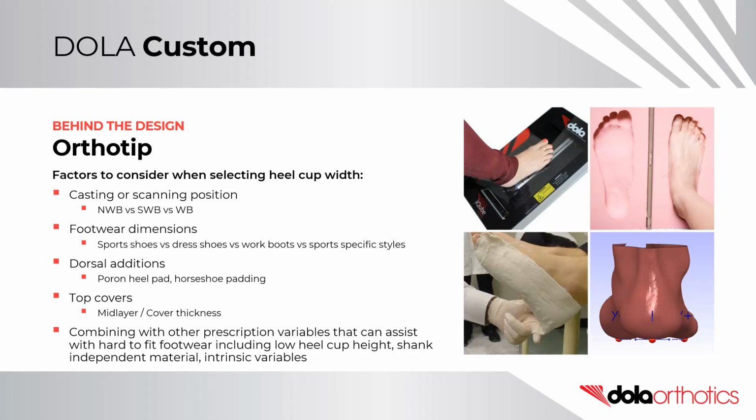Combining with other prescription variables that can assist with footwear fit include a low heel cup, a shank independent material, or intrinsic variables.